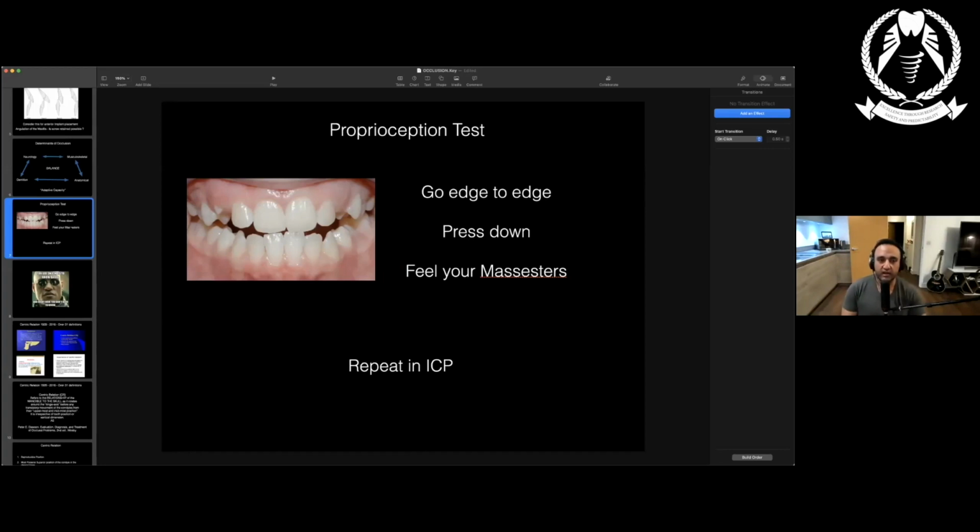And one thing I'm going to tell you is how to assess occlusion in implants, whether it's single teeth or advanced restorations, through the experience of making mistakes myself, because we make mistakes, things go wrong, and you wonder, why has this happened? I've done everything right, the lab's done everything right. And often it boils down to, again, occlusal assessment, assessing your patients. So that's a really important point overall.